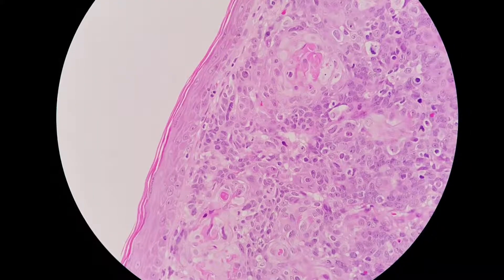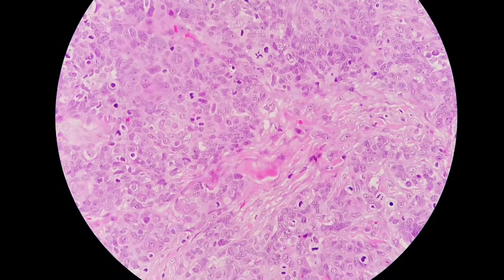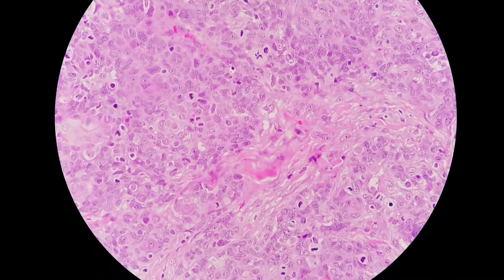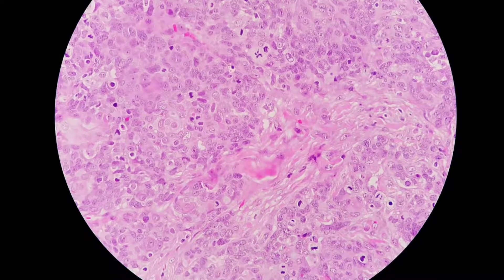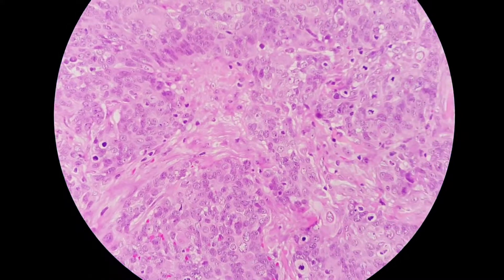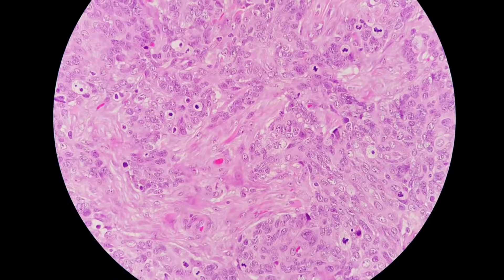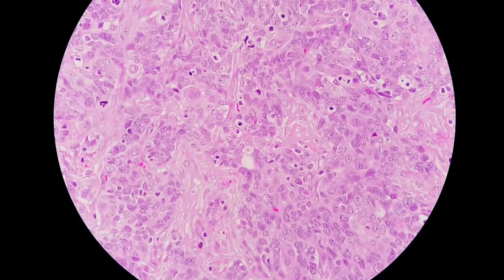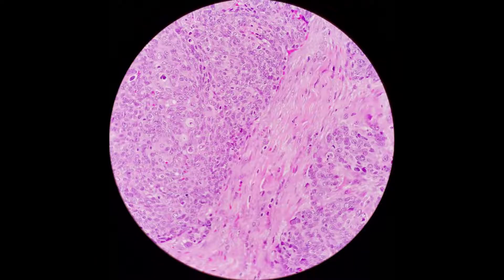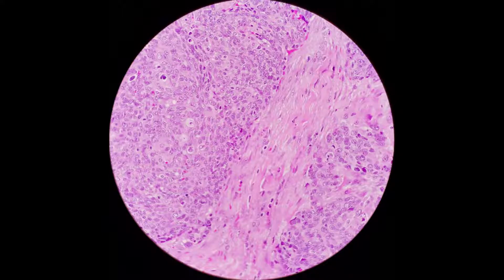For detailed characteristics of this tumour, we use high magnification. The squamous cell carcinoma has moderate nuclear pleomorphism, which is assessed by comparing the differences between the sizes of the nuclei. You can see sheets of squamous cell carcinoma. In between the cells is the stroma, which appears to be desmoplastic — the area surrounding the carcinoma made up of fibroblasts.